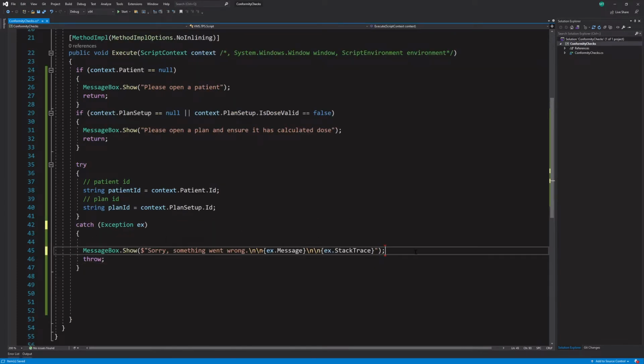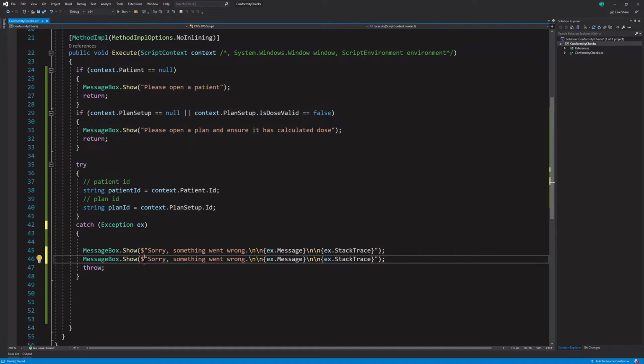So I'll just show you real quick. If you can't use string interpolation, then what you would do is string.Format. Then we'll add another parenthesis at the end. Instead of putting x.Message here, we'll get rid of that. And after the string, inside that string.Format parenthesis, you add in whatever objects that you have. So we'll put in a 0 here as a placeholder, and then we'll cut this and put in a 1. And remember, this is zero-indexed, so the 0 is the first index.